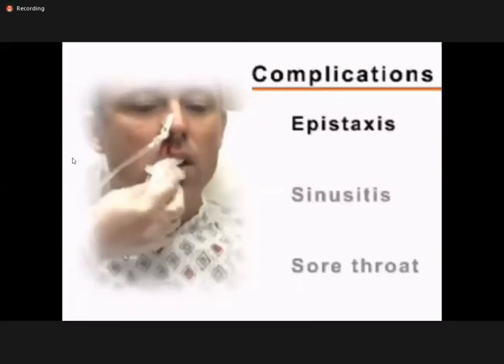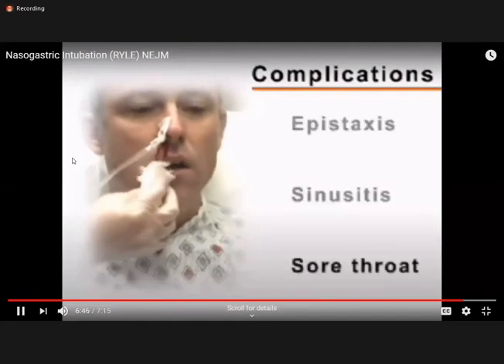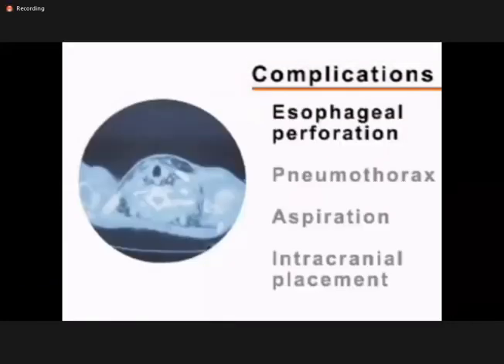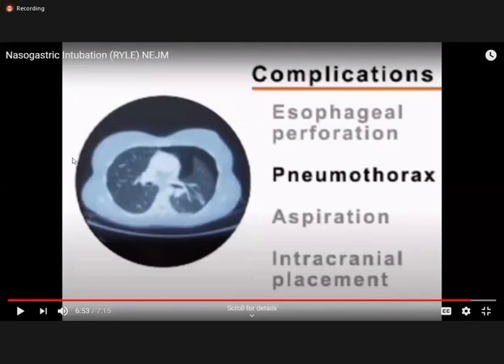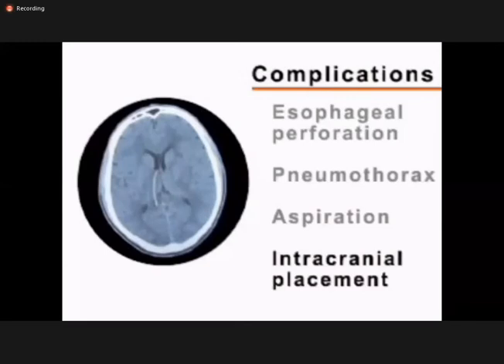Minor complications of NG tube insertion include epistaxis, sinusitis, and sore throat. More serious sequelae include esophageal perforation, pneumothorax, aspiration, or intracranial placement.